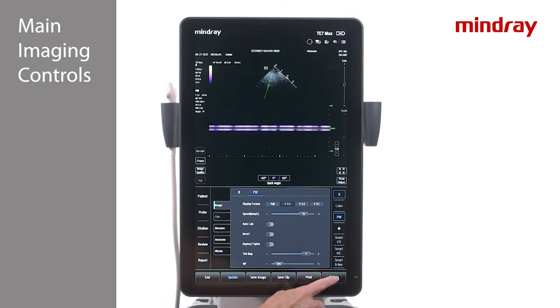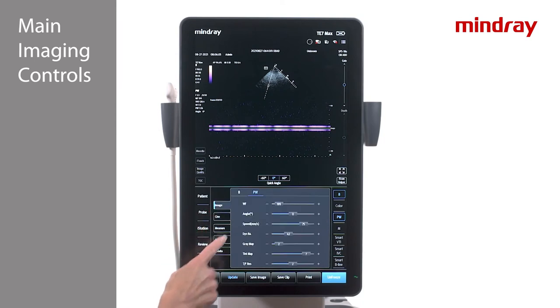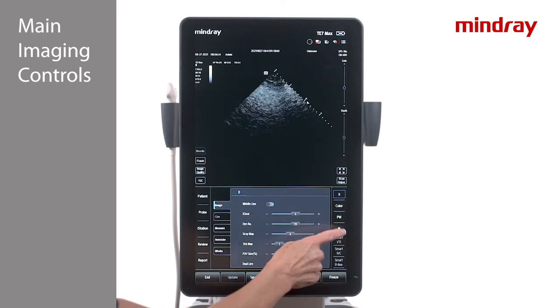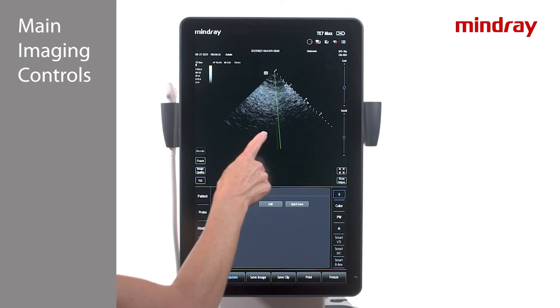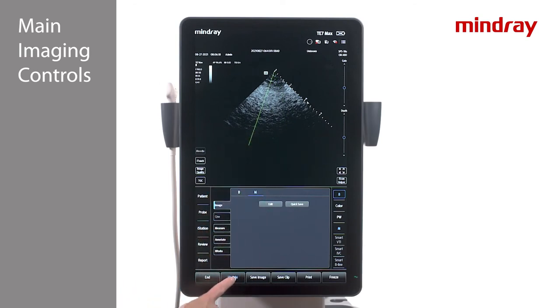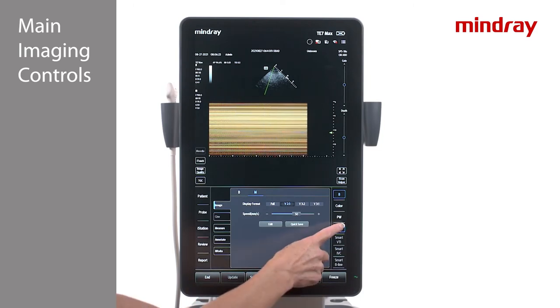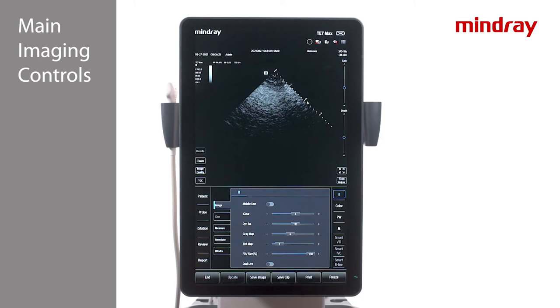Notice while in PW mode, the options under the Image tab have changed to PW, which is highlighted in blue. To access M mode, press the M key on the right side of the touch screen and position the sample line on the image. Enter M mode similar to PW mode: press the M key again, press the update key, or double tap on the M mode cursor. To exit M mode, press the M key again or the B key.